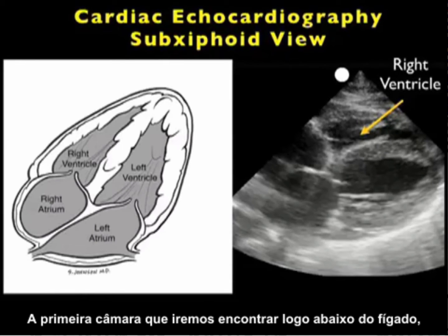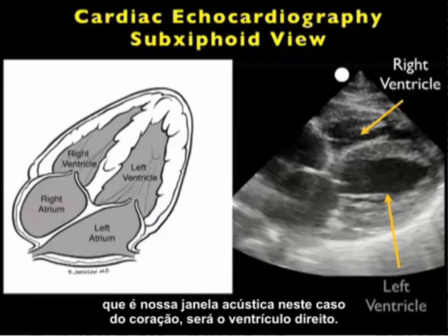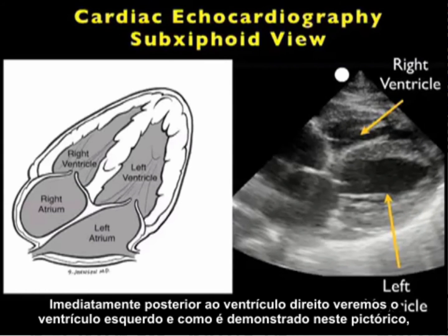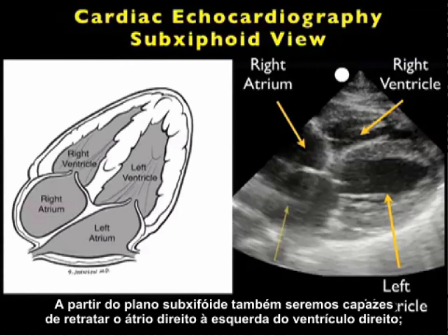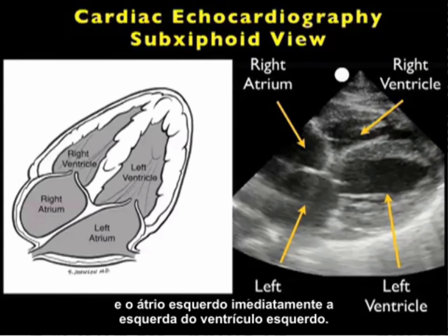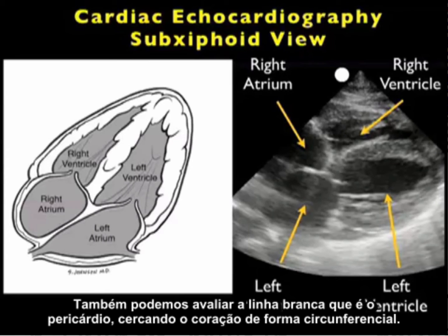The first chamber we'll encounter directly below the liver — which is our acoustic window in this case onto the heart — will be the right ventricle. Immediately posterior to the right ventricle, we'll be seeing the left ventricle. Notice that it has more muscular and hypertrophic walls. From the subxiphoid plane, we'll also be able to image the right atrium to the left of the right ventricle, and the left atrium just to the left of the left ventricle. We can also appreciate the white line that is the pericardium circumferentially surrounding the heart.